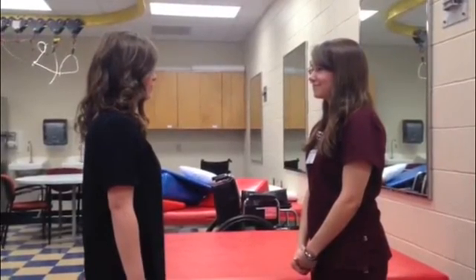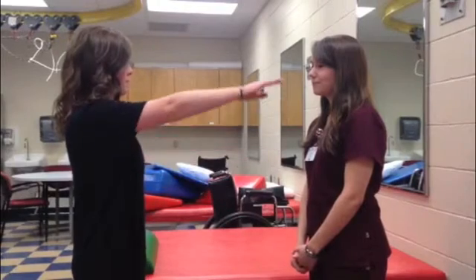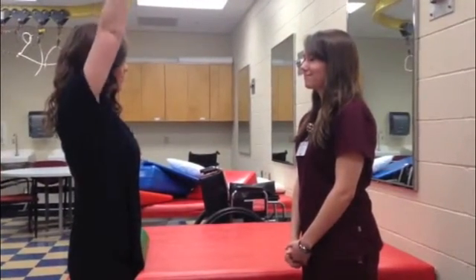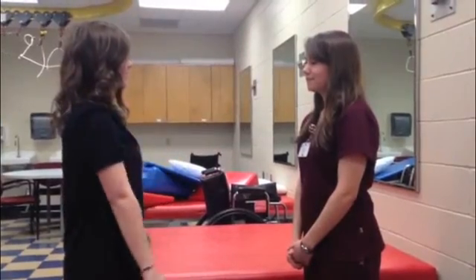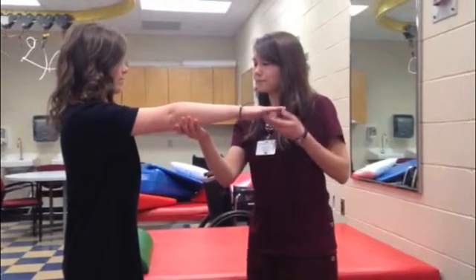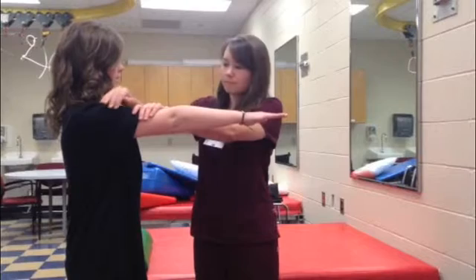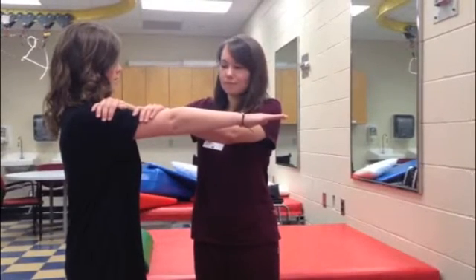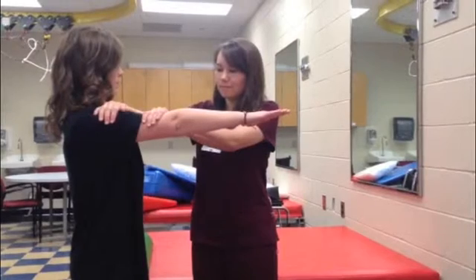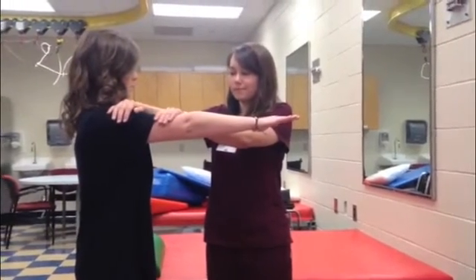As the patient performs this motion, watch for signs of exertion or any abnormal substitutions. If the patient can perform this motion, ask them to raise their arm to about 90 degrees and hold it there. Stabilize the shoulder proximally and apply resistance distally at the elbow without crossing the joint. The muscles acting in this motion are coracobrachialis, biceps brachii, and anterior deltoid.